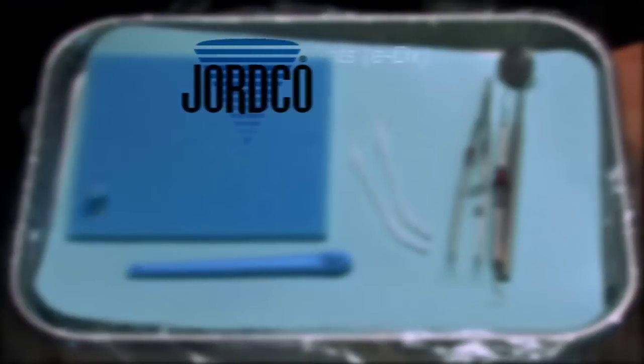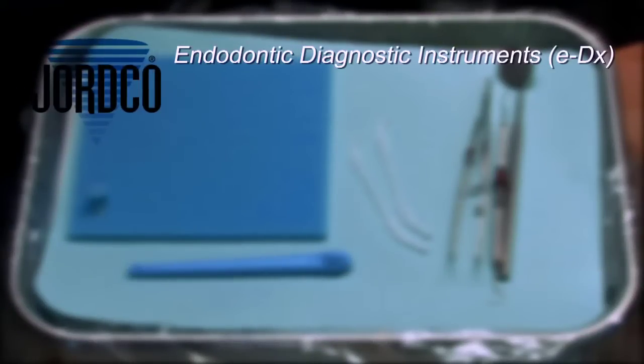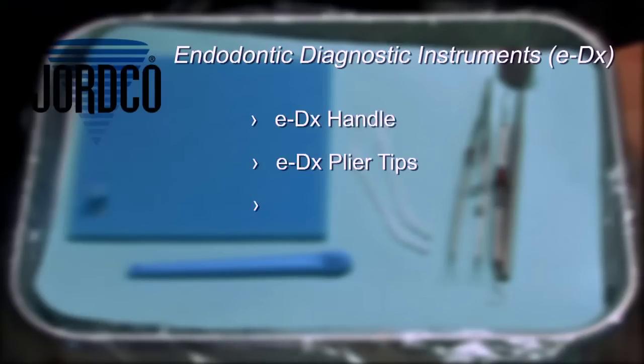Jordco's endodontic diagnostic instrument, the EDX, is made up of three components: the handle, retentive plier tip, and the foam insert.